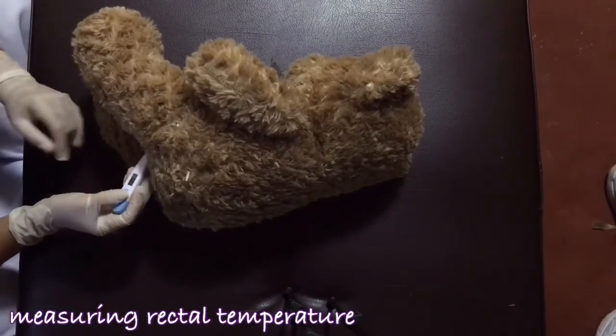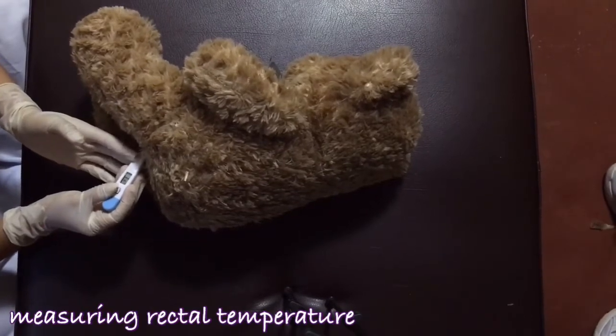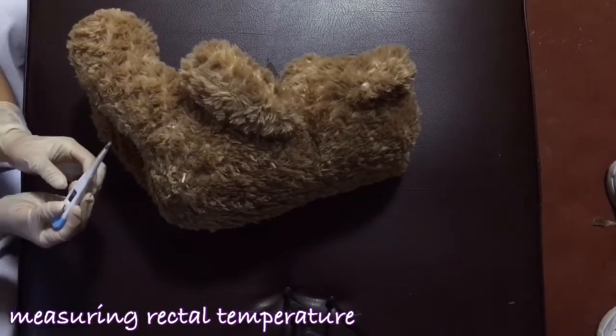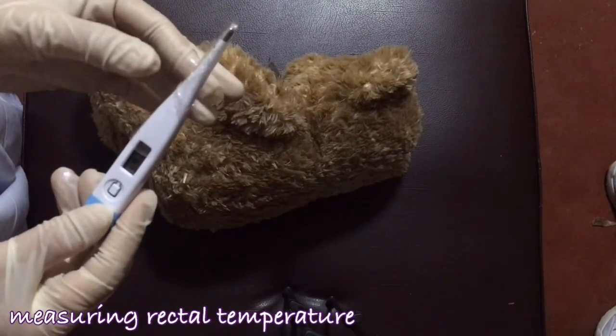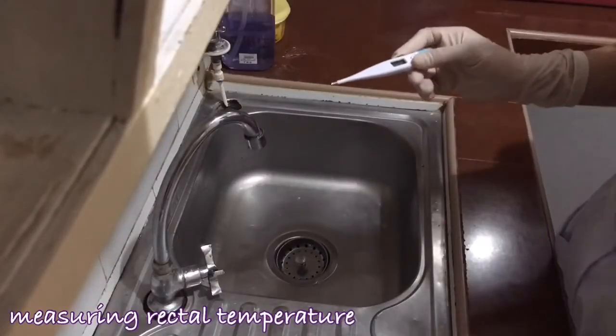Then after, slowly remove the thermometer from the patient's rectum. After removing the thermometer, I will now read the temperature, dispose of the probe cover, and clean the thermometer.